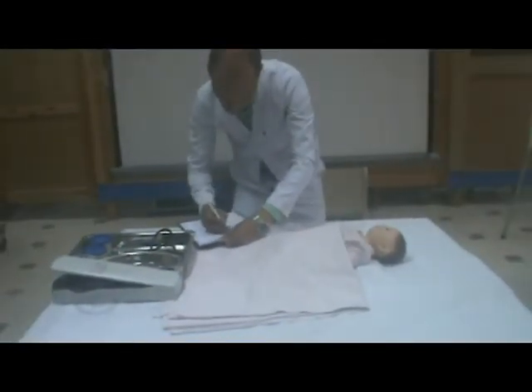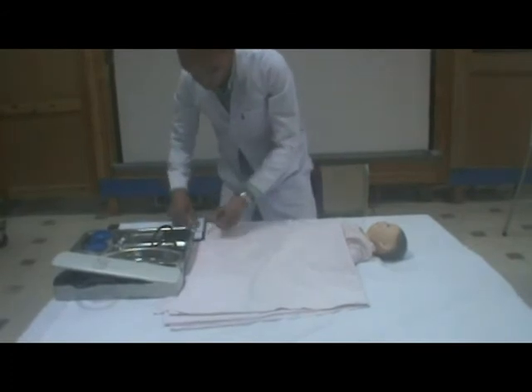Number 7, count for 1 minute, as sufficient time is required to detect irregularities or other defects. Number 8, record the pulse rate, rhythm, and strength. Number 9, clean and return equipment to safe storage.